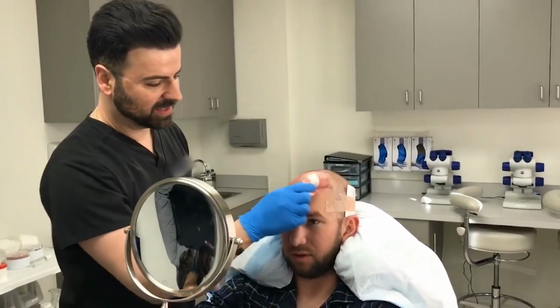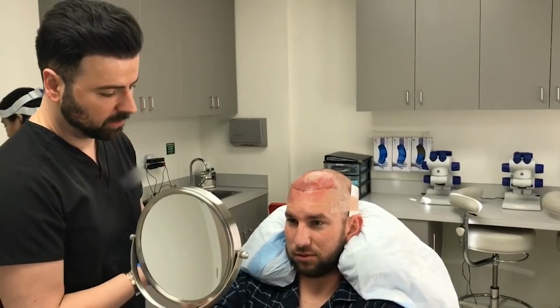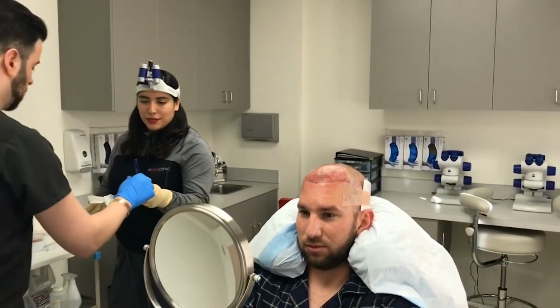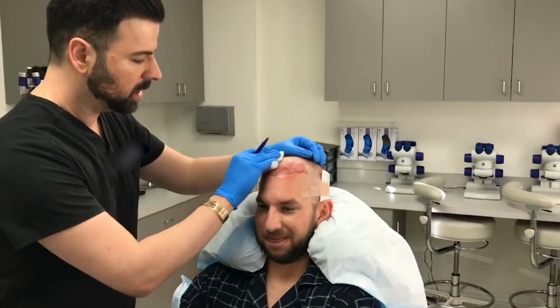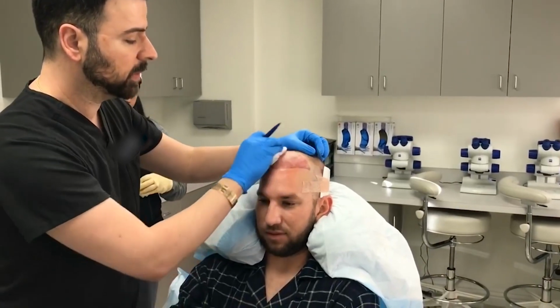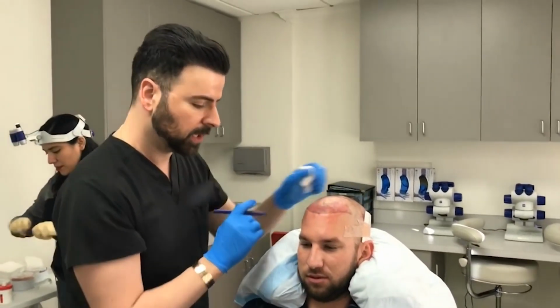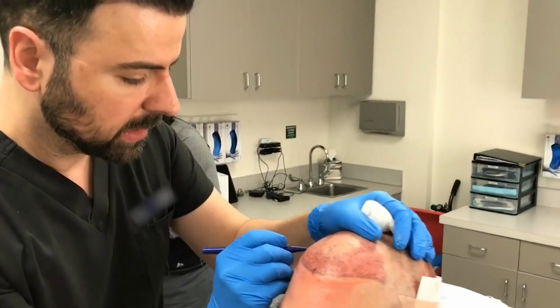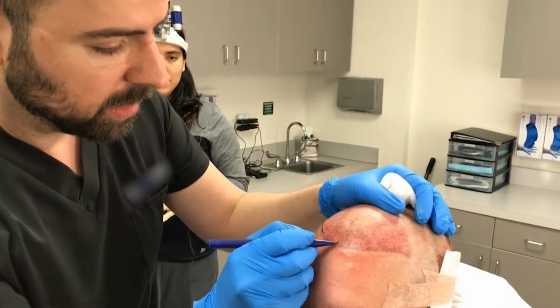Nothing big. Alright, so what we're going to do now is we're going to outline where every single graft that we harvested earlier will be implanted. So ignore the surgical marker. I'm just going to outline every single one of these grafts. They have their own specific location, okay? So what we want to do is place the singles in the very front to give you a natural looking hairline.